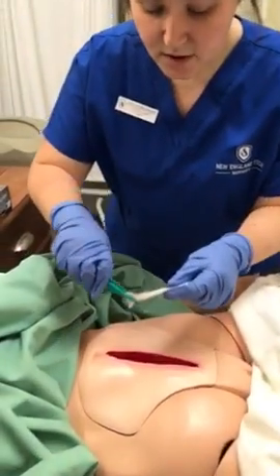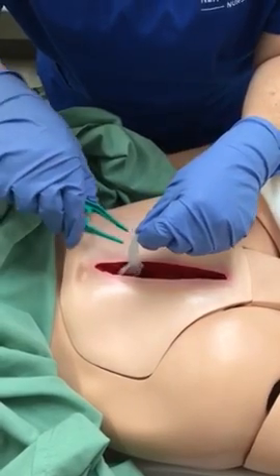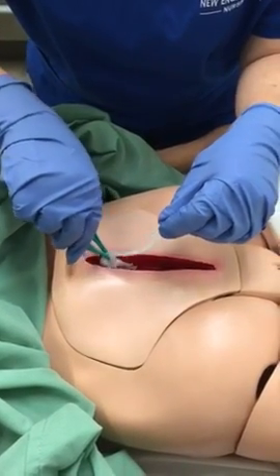I'm going to ensure that without touching the patient's skin and only the inside of the wound, that I am able to pack it with 2 gauze.